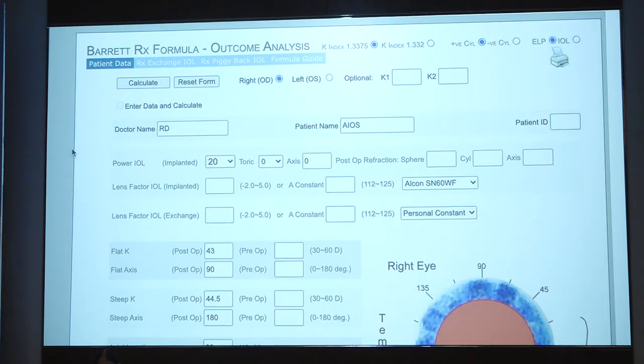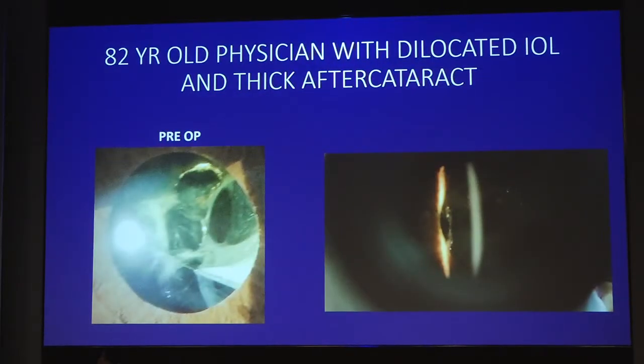Okay. By the side, you have the next option, if you want to exchange the lens, and then you have the piggyback lens formula. So this makes it very, very simple. You enter your usual K1, K2, and your axial length and the power that you have, and it will tell you whether you can rotate your current intraocular lens or you have to exchange it.